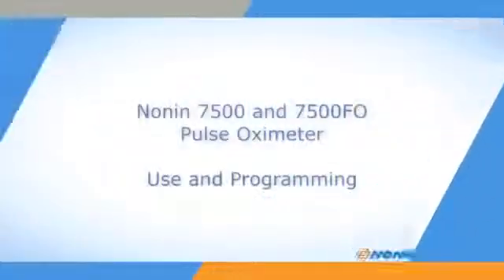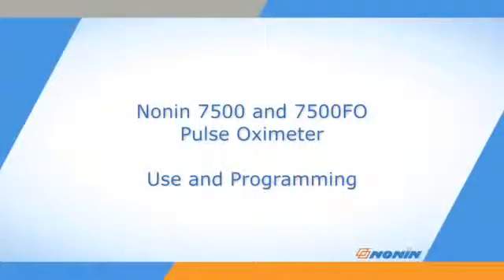This short video shows how to properly program, connect, and operate the Nonin Model 7500 and 7500 FO pulse oximeters.